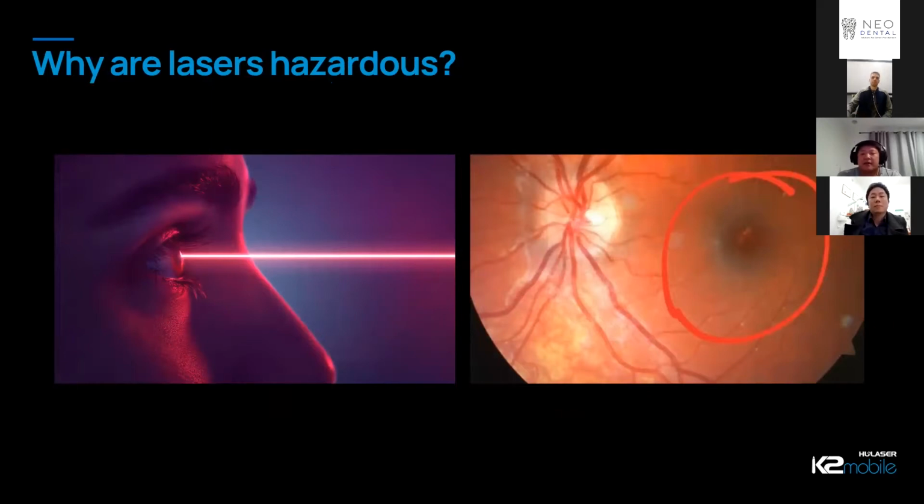And I think it's fair to say, you don't need to be an optometrist to realize that there's something wrong with the retina in that photo. And that photo is taken from a site where it said that this damage was induced from a laser. So we have to be very careful when using these.